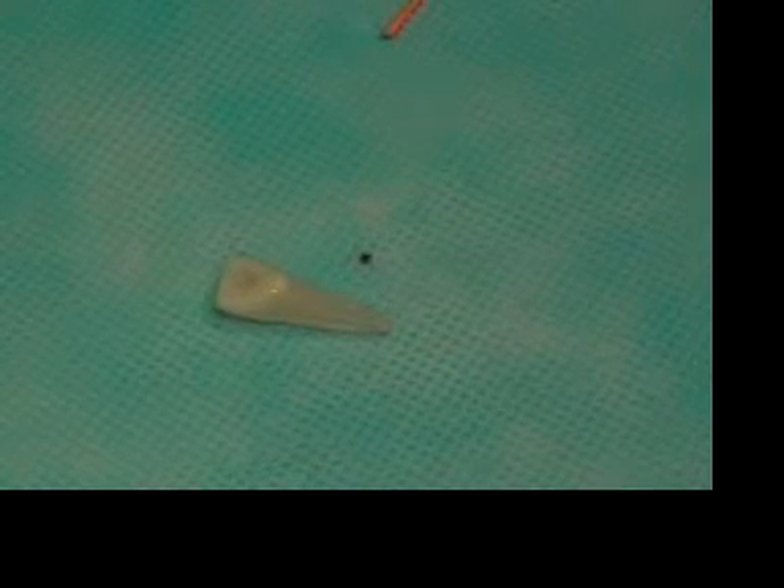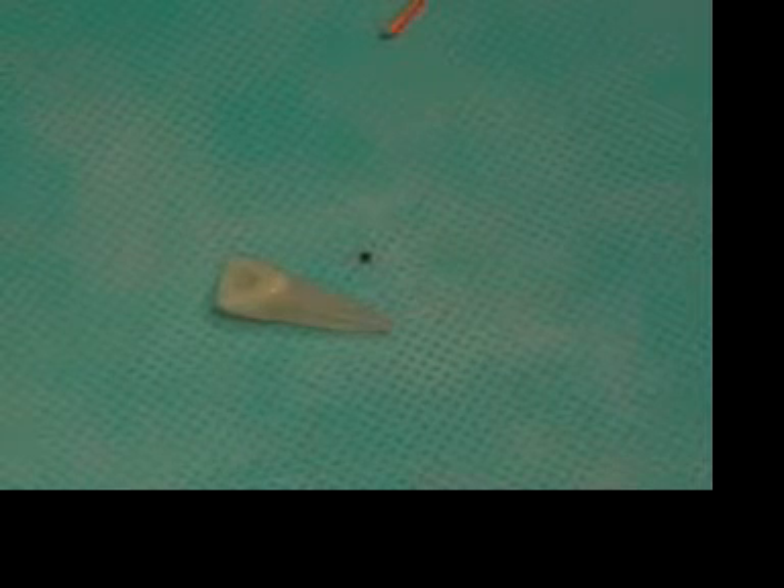We've cleaned the apical portion of the canals with our master apical file to make sure there's no debris packed down there. So the next step we want to do is we want to select the largest plugger to go one half the working length.